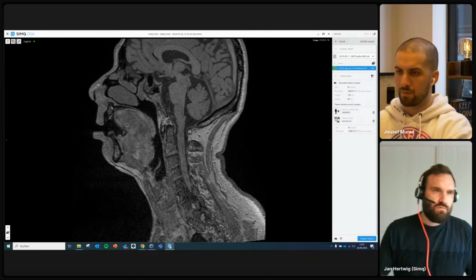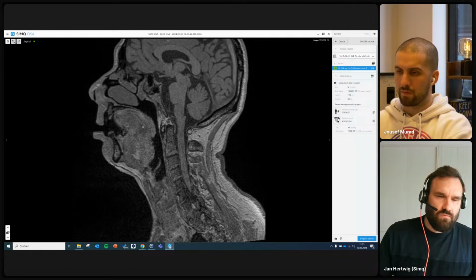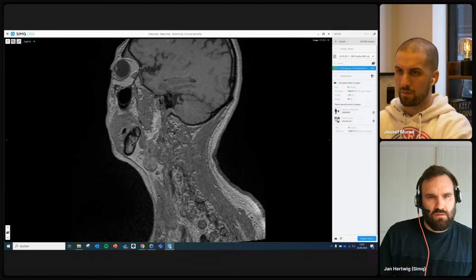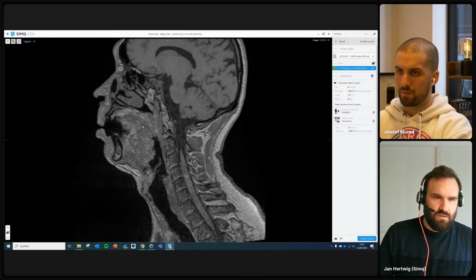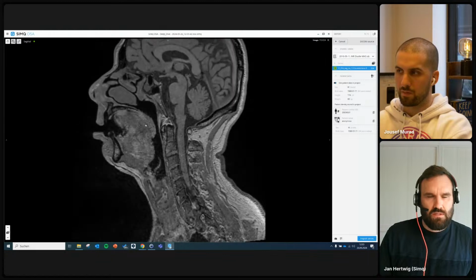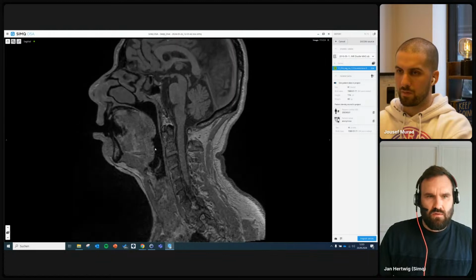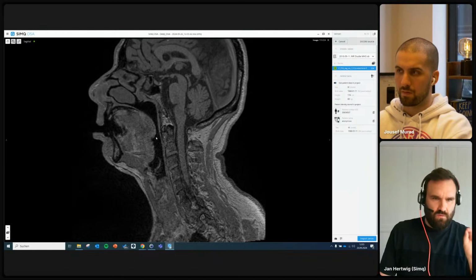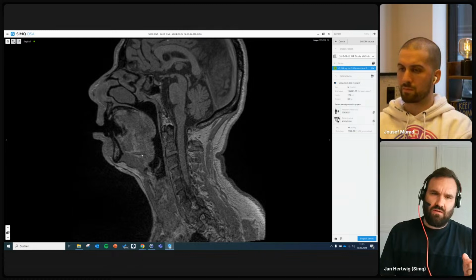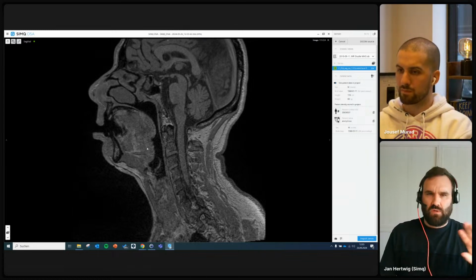Here in the software, a functionality of the platform is also rendering DICOM data, so you can scroll through them and show those MRI data. What you have to know is that those MRI data are just voxel data, so actually just slices with pixels with a depth, and you cannot really interpret them very well or make a simulation model out of them.